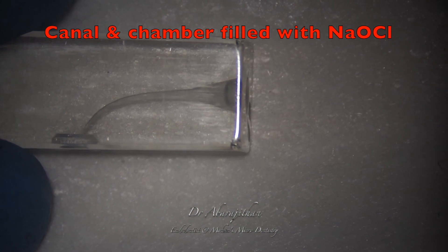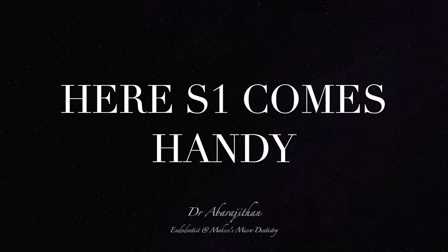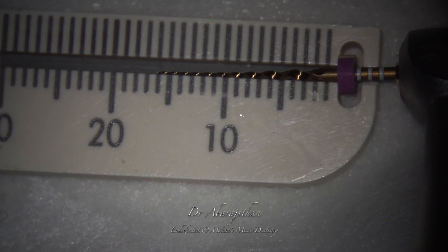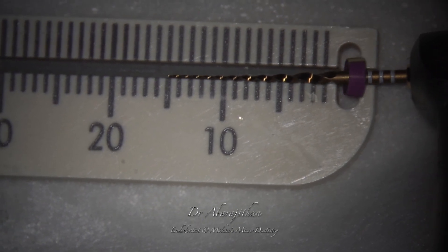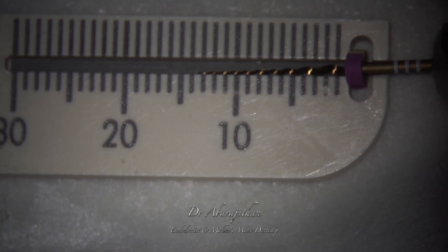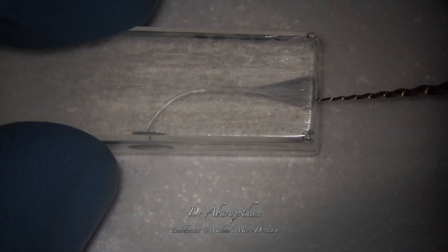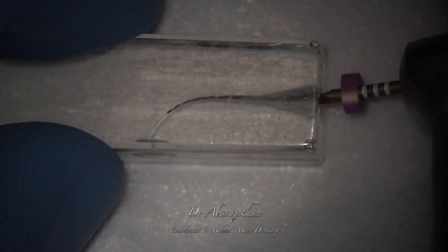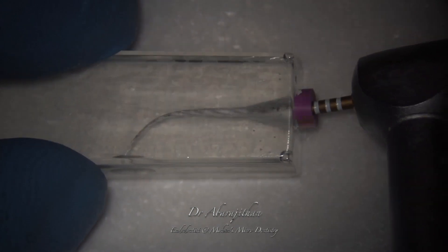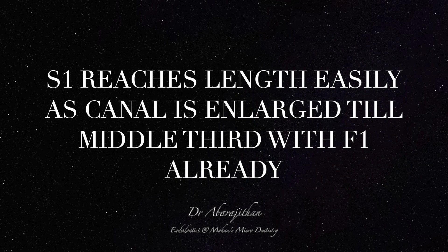Here also, we fill the pulp chamber with a lot of fresh sodium hypochlorite. And here's the difference: in such a situation, we will use the S1 — that is the purple Protaper Gold. We measure the working length using a radiograph or an electronic apex locator. The S1 is adjusted to working length with the endo ruler, and you'll find that S1 will reach the working length very easily in 3 seconds. This is because the coronal hindrance has already been cleared by using F1, which acts almost like an orifice opener.